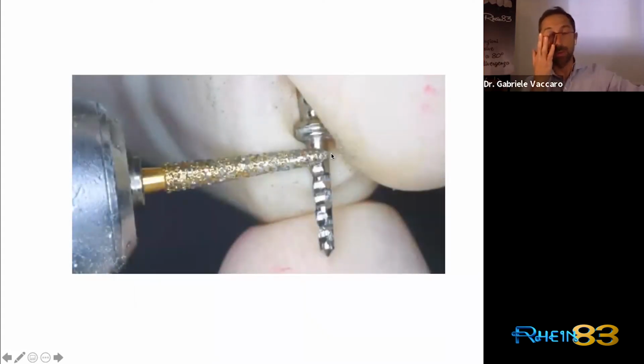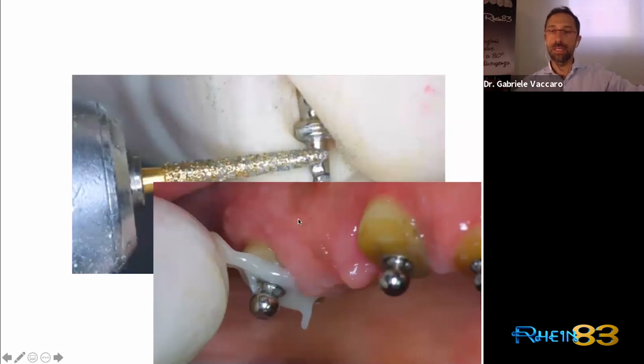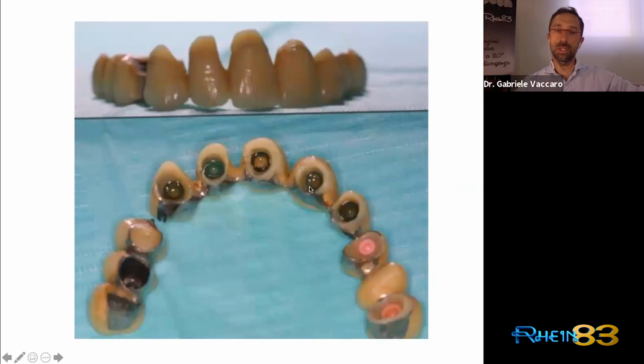Cut all the crowns, make the root canal therapy in all the residual roots, prepare the post, the endopost for the endopivot for every root, cement it on every root, and then reline her bridge directly over those residual roots, so she could leave the office with her teeth.